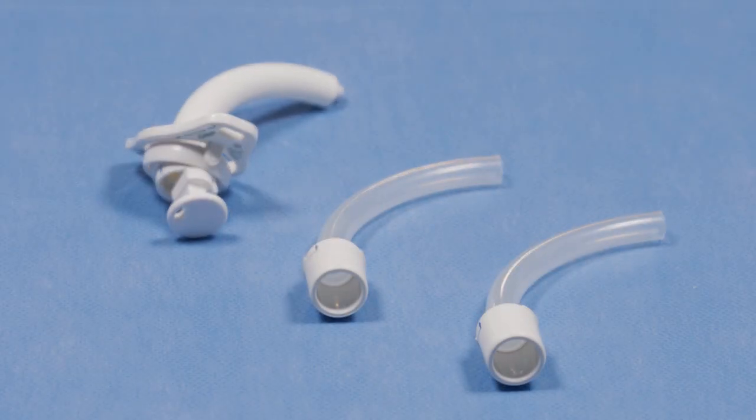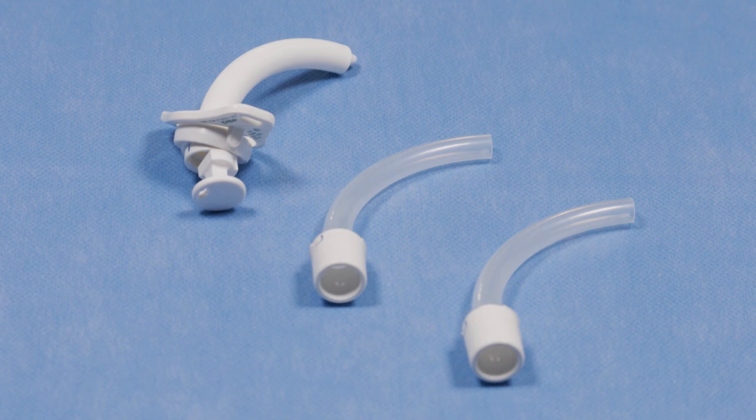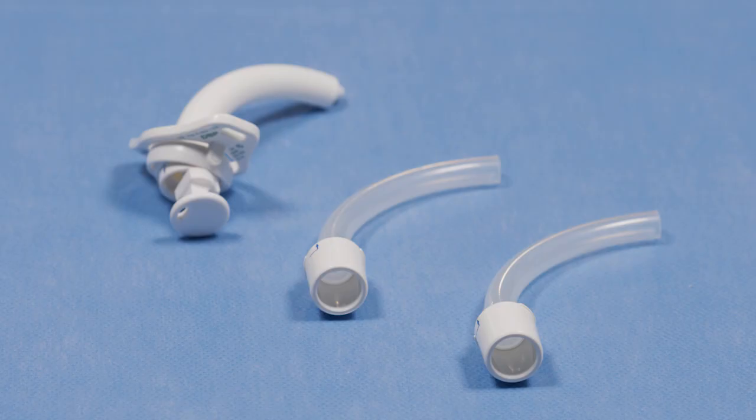We can also use Tracheotwist tubes for children. It tends to be for adolescents or children that haven't got a lot of head control. The Tracheotwist tube reduces the amount of emergency changes you have to do, because you can change the inner tube if it's becoming blocked. The inner tubes themselves need to be changed at least every four hours.